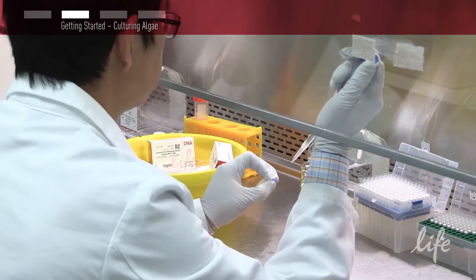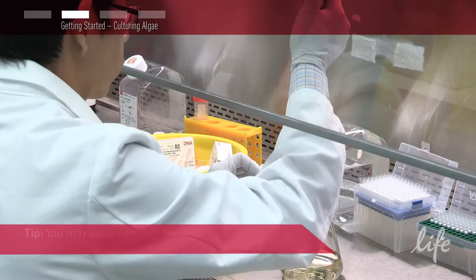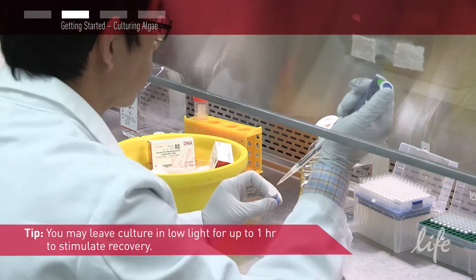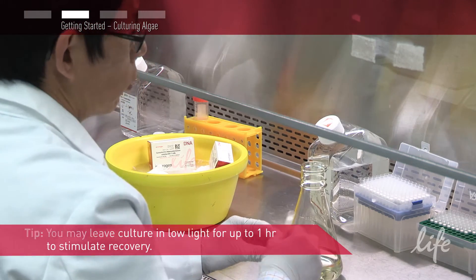Next, transfer the full volume of cells into 200 ml sterile TAP that is pre-warmed to room temperature. Use a 500 ml flask. If possible, do this step in a sterile hood, but this can be done on the lab bench.